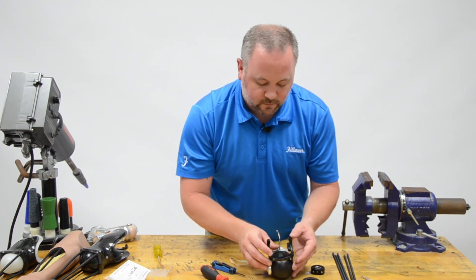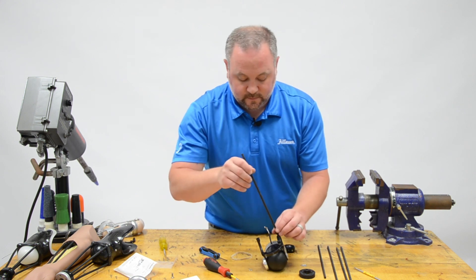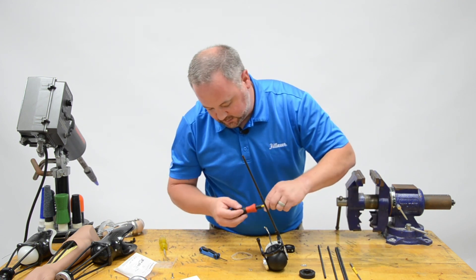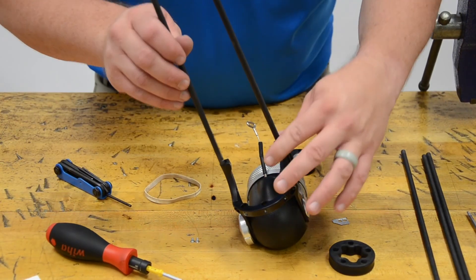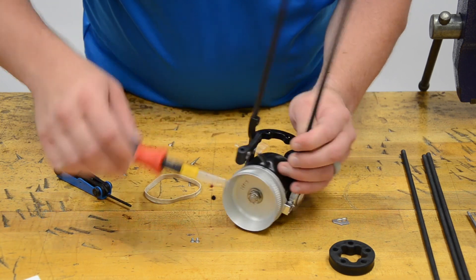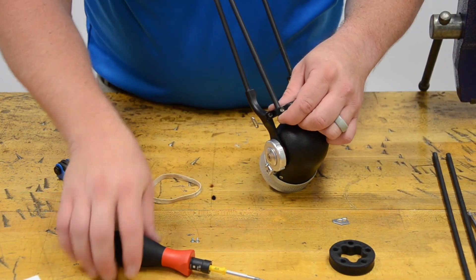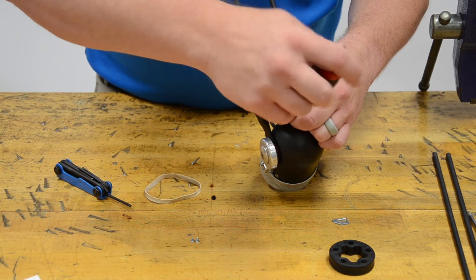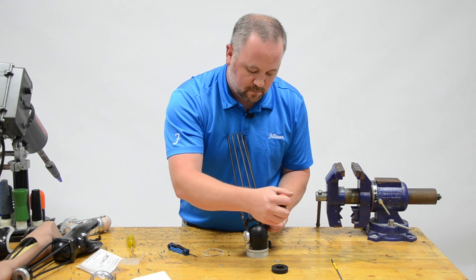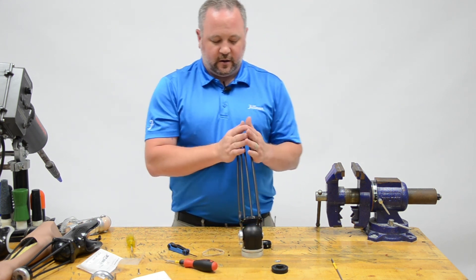Now we're going to go ahead and install our rods. These are going to use 3/32nd set screws. Two go in at the top and three down on the bottom. Make sure to flush those up to the bottom edge. Now all rods are in place, and it's moving very freely with the added weight. These rods are very lightweight.